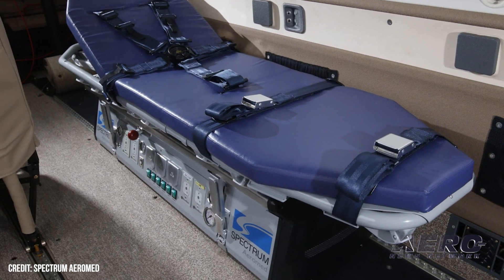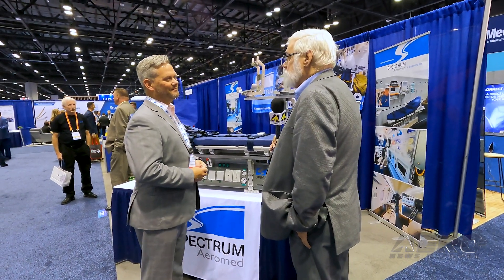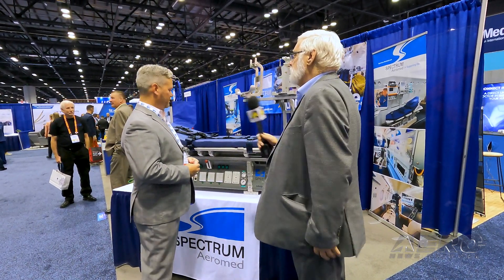A quick scan of the device indicates a lot of capabilities. Tell me what it's bringing to the MEDEFAC environment.